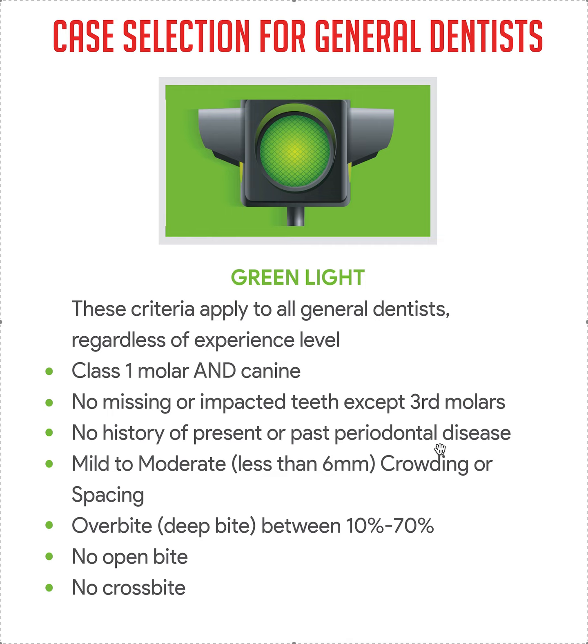I know this is harder because those of you who are general dentists, a lot of your practice is older. We're gonna get there. Those are gonna be more advanced. It just complicates things and makes it less predictable. So I'm trying to have you stick with super simple cases. And I realize with these restrictions, it's gonna be a very small percentage. It's okay if you're taking yellows, which we're gonna get to, but you need to have an orthodontic consultant helping you with those yellows. These you can do on your own.